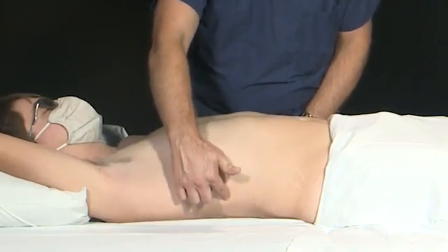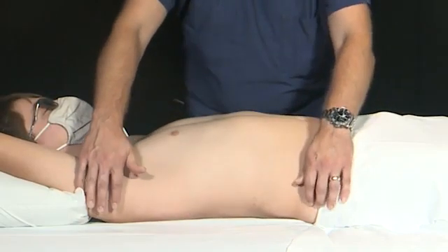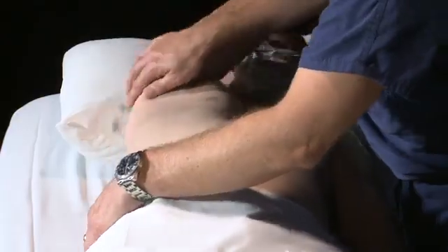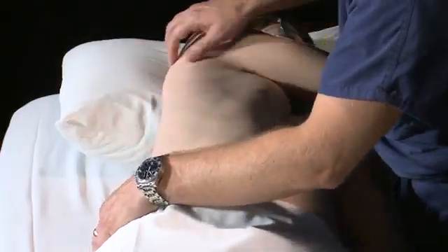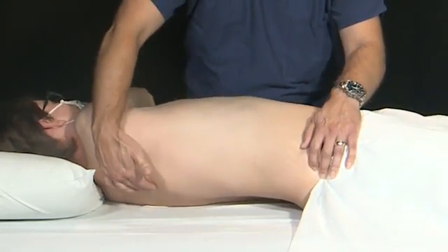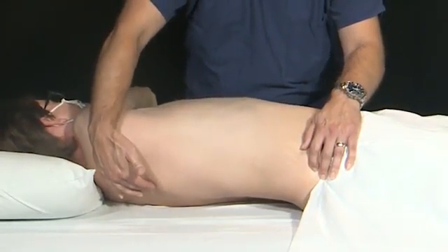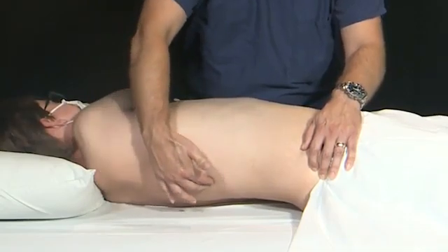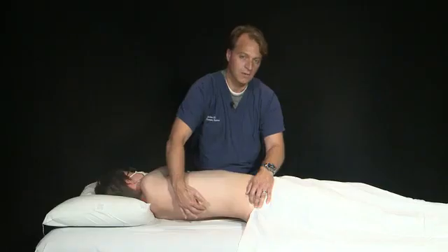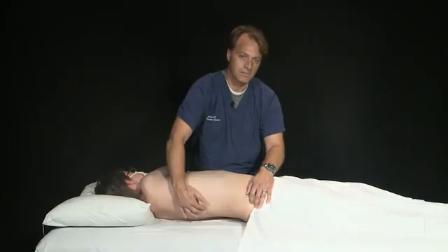In this imaging protocol, we're likely going to need to roll the patient onto their side so that we can get beyond the scapula superiorly and image down the chest into the inferior portion of the lung.